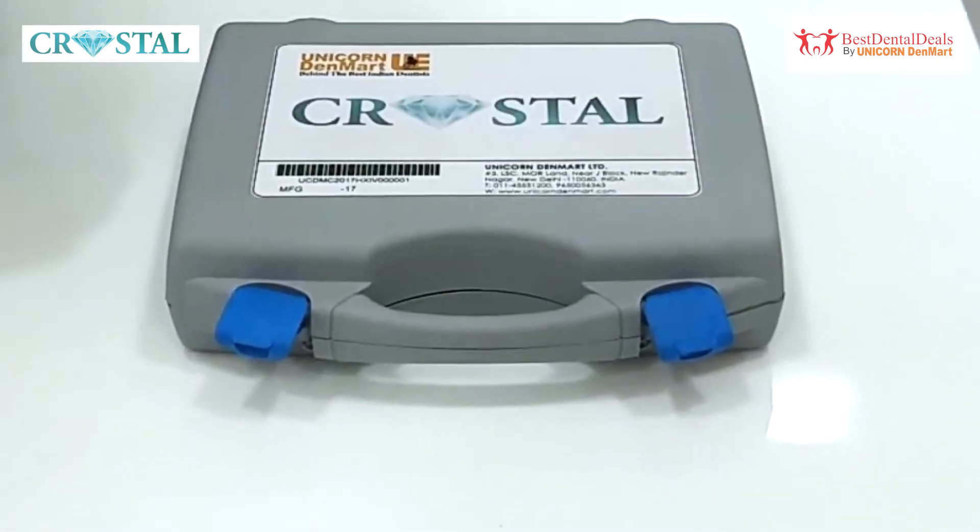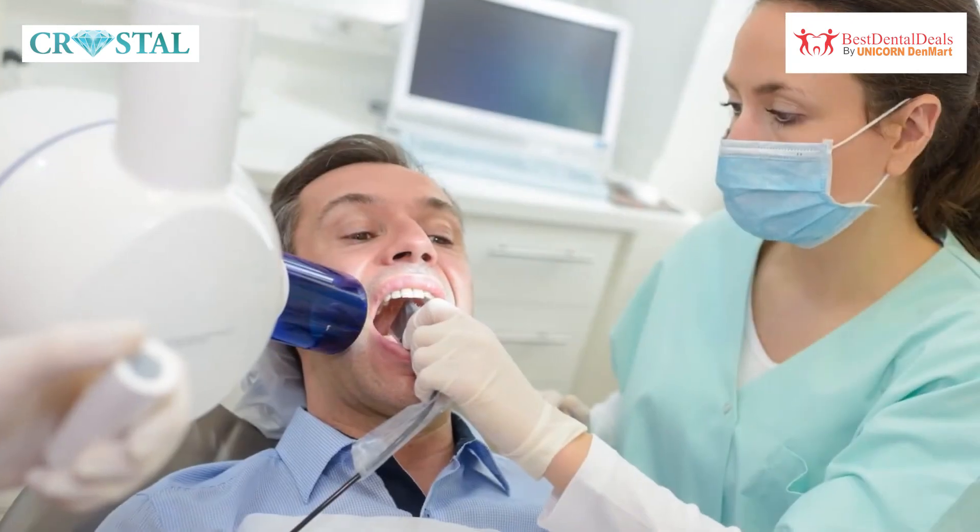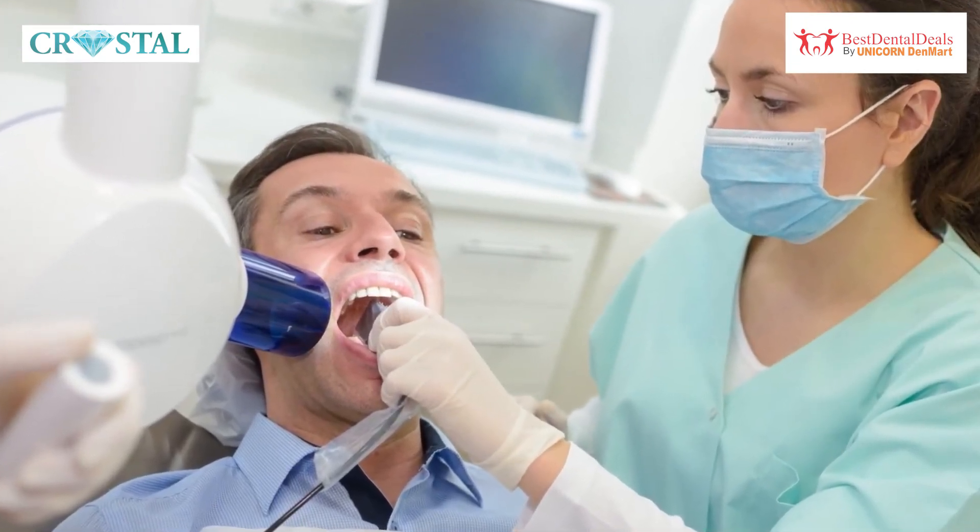The Crystal RVG comes with a 5-year warranty and is an ideal choice for dentists looking for a sensor in an economical range.